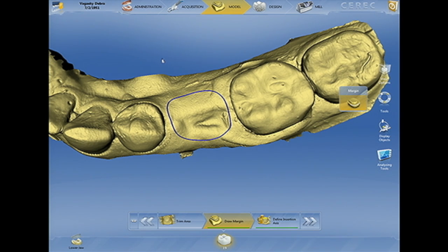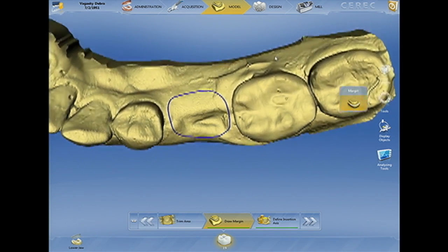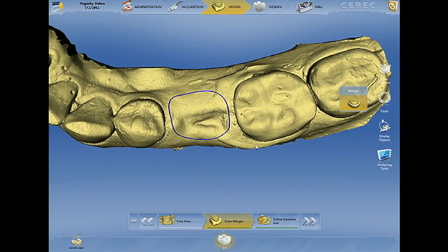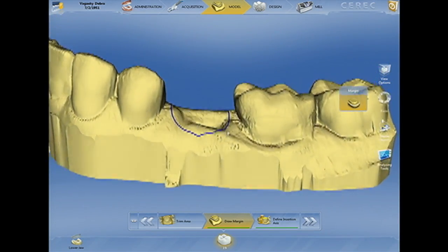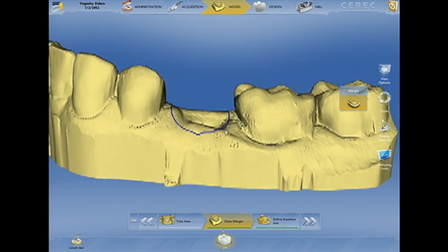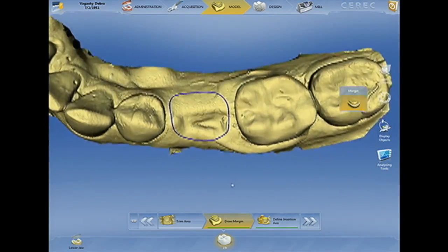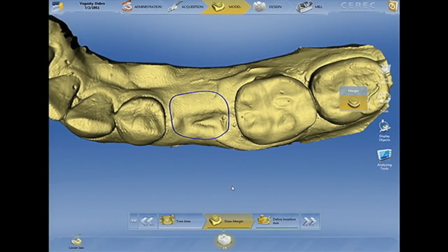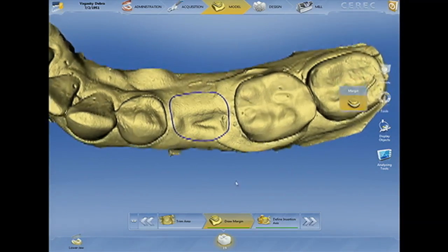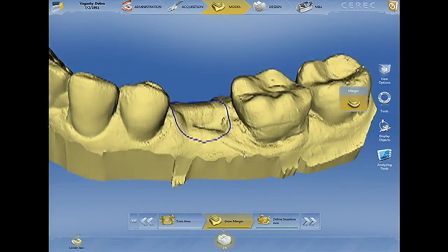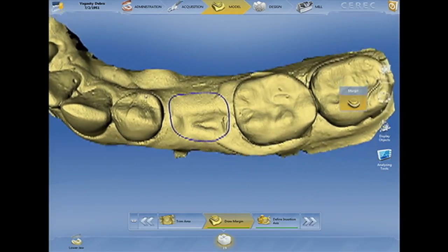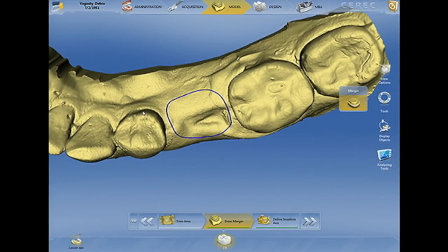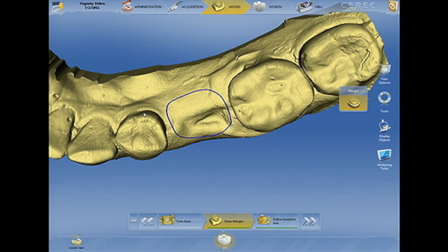What we've done is we've taken an optical impression for site number 20, and immediately you can recognize that this site is fairly large for a conventional tooth number 20. So in the CEREC software, what we have to do is tell the system that although we're designing a restoration in the site of number 20, it's going to be tricked into designing a tooth by selecting 19 in the proposal in the administration section of the software.